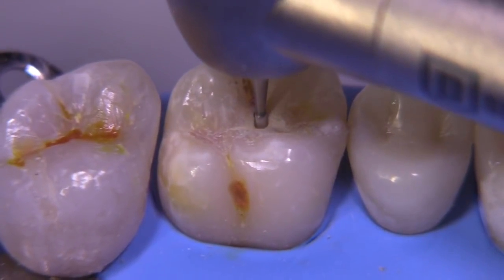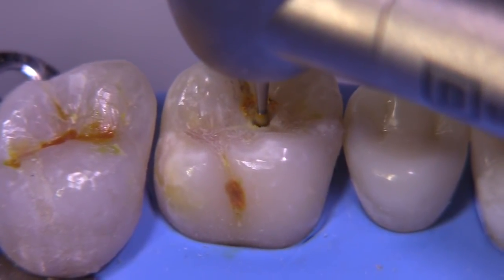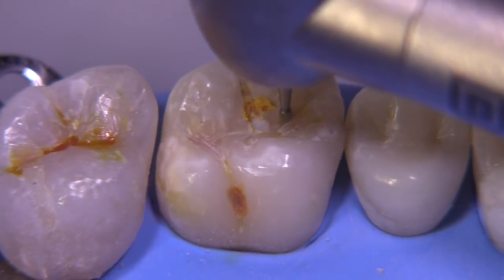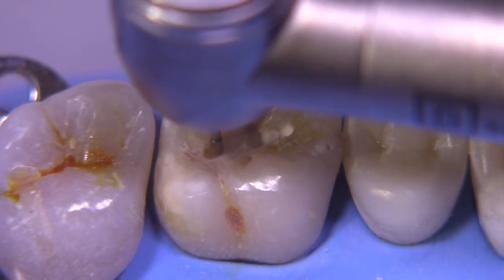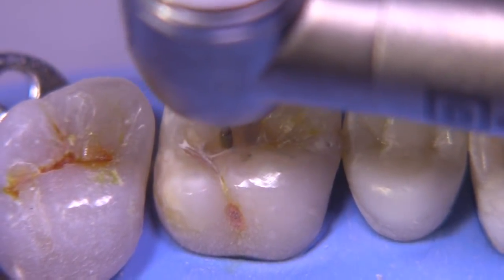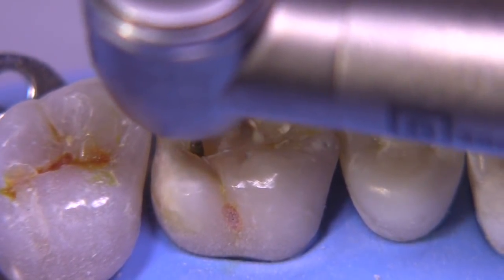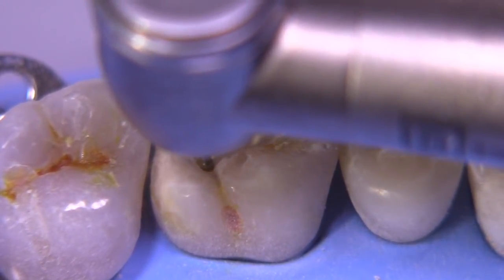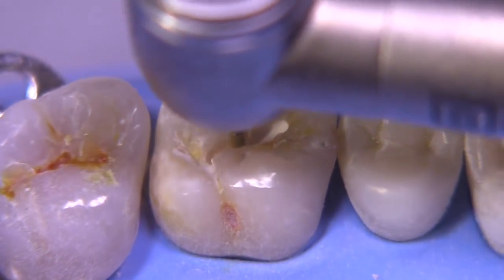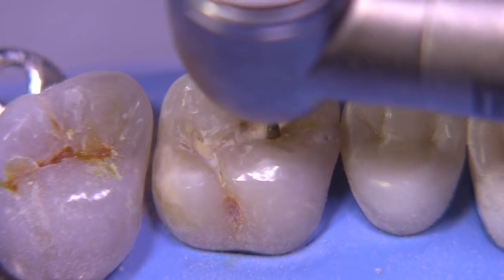We don't know how deep and we don't know how wide things are going to be at this point. Typically in a case like this, I would be thinking that a direct composite would be a very acceptable, appropriate restoration. We might even be able to spare that oblique ridge if possible, but in this particular case I went ahead and crossed it so you can see what the outline form might look like if we cross the oblique ridge.